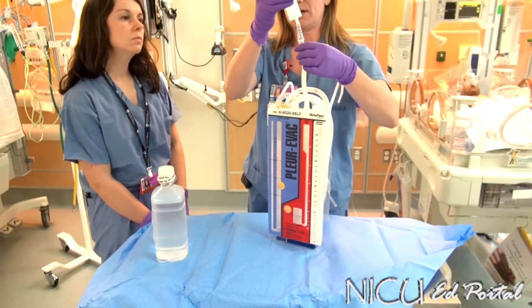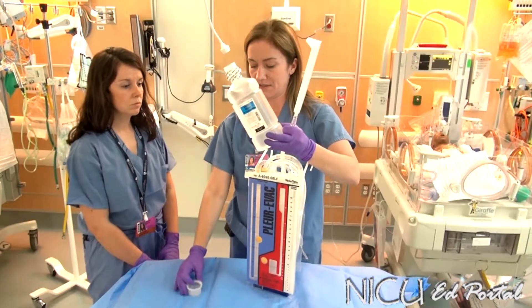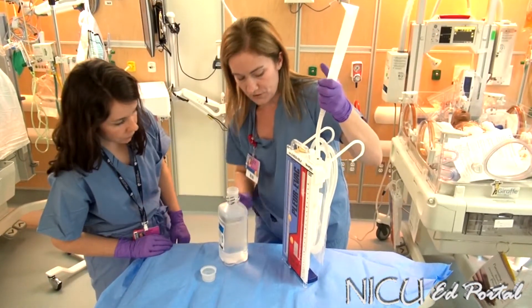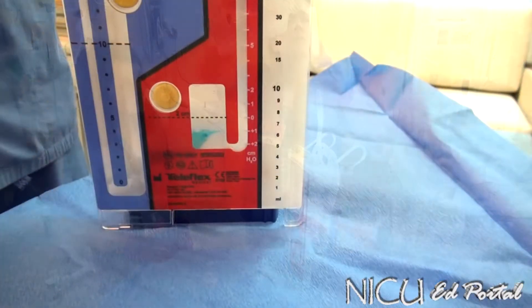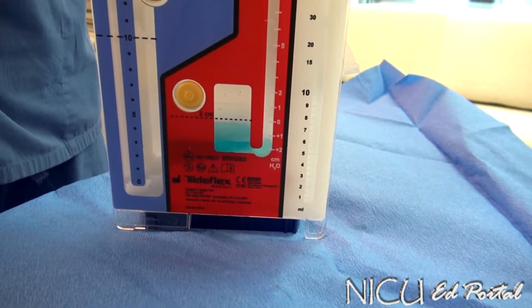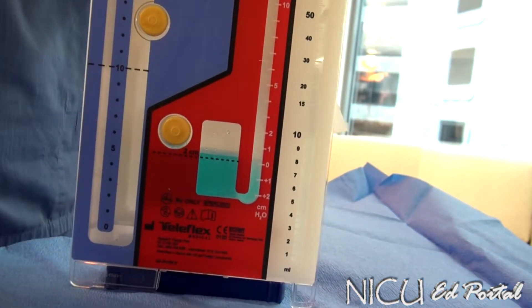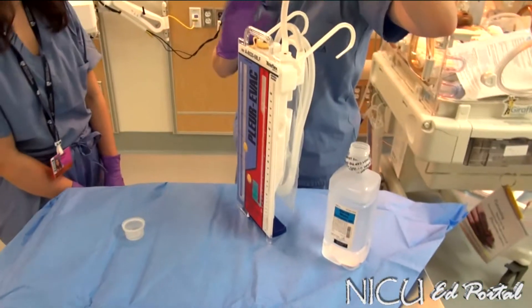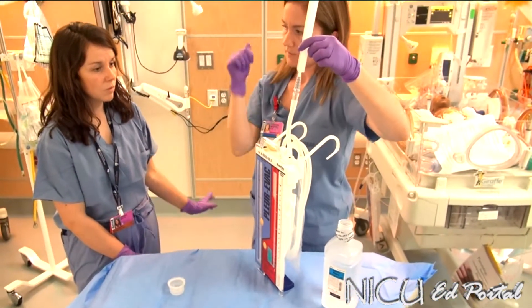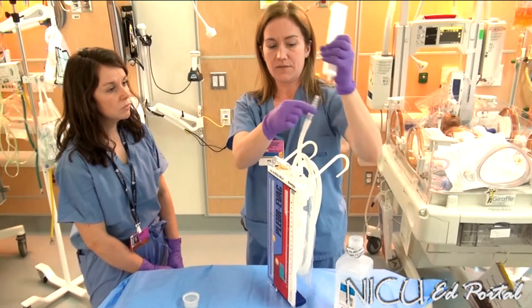I'm going to put my funnel on and open up my sterile water. You can eyeball — I'm filling right to this black two centimeter line. The funnel fills up sometimes quicker than the chamber, so you can help let me know when it gets there. Now remember, this is a closed system, and this part is going to go to the wall suction — so we're going to take that cap off, as it has a dual purpose going to the wall suction.